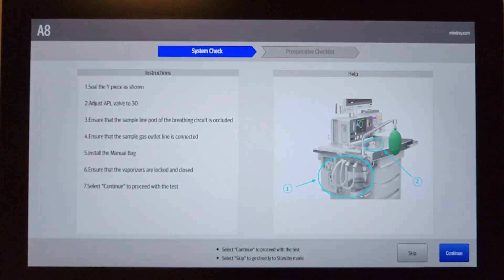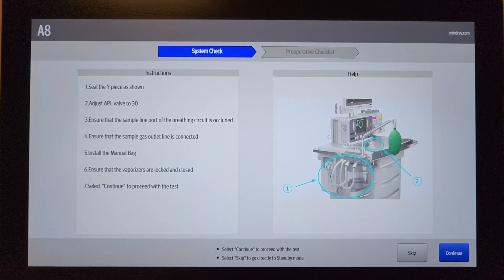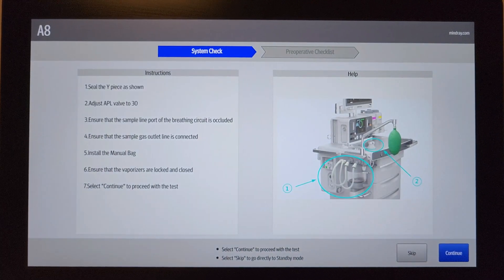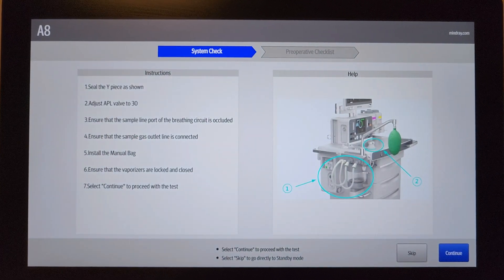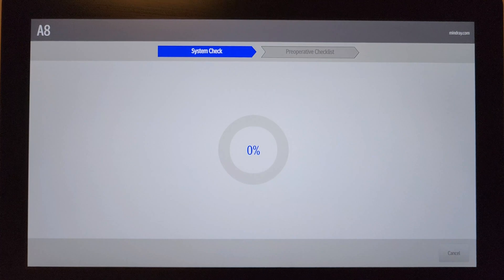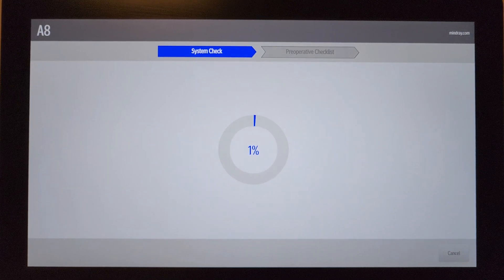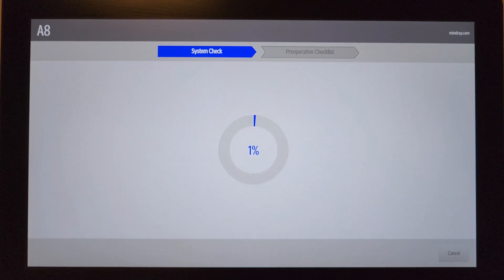And all the rest of this should be working. Make sure the vaporizers are closed or it'll consider it a leak. You can hit continue, and that's how you do your pre-op check.